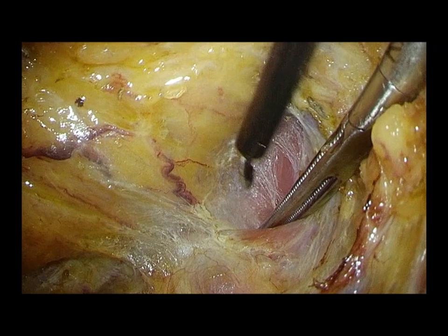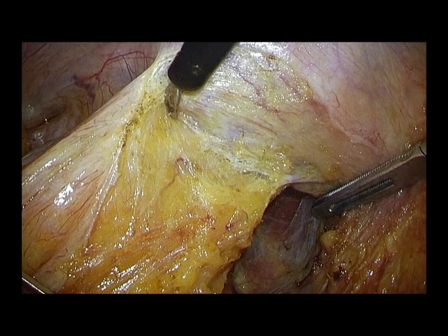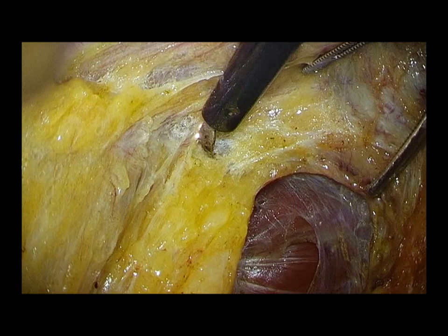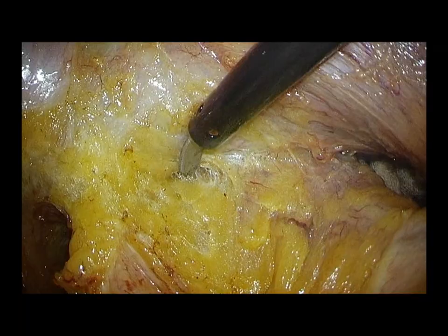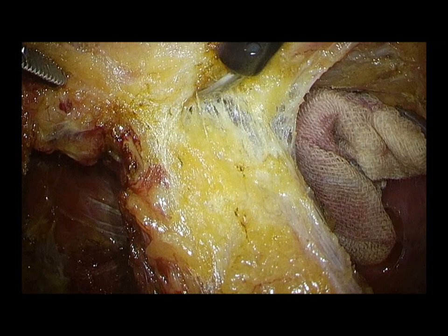On the anterior side, the whitish connective tissue on the seminal vesicle is carefully preserved. Behind the seminal vesicle, the neurovascular bundle is identified and carefully preserved with the covering whitish connective tissue. As the dissection goes distally, the neurovascular bundle approaches medially.